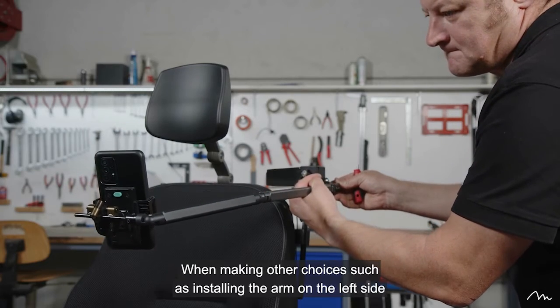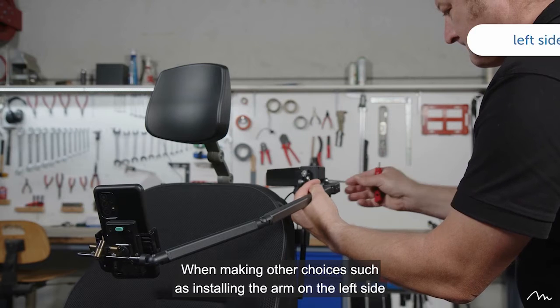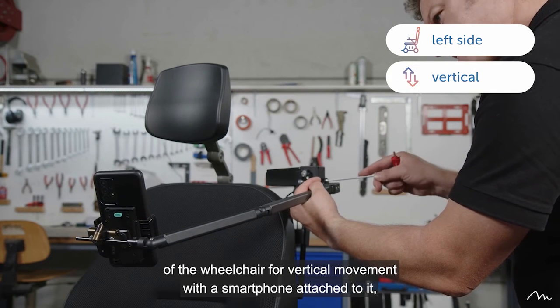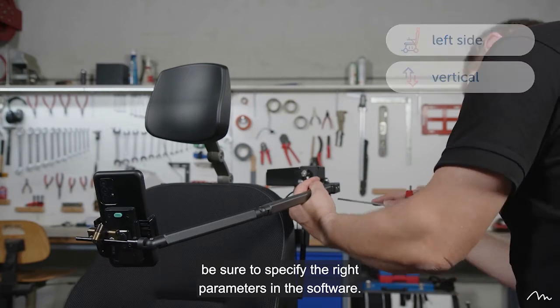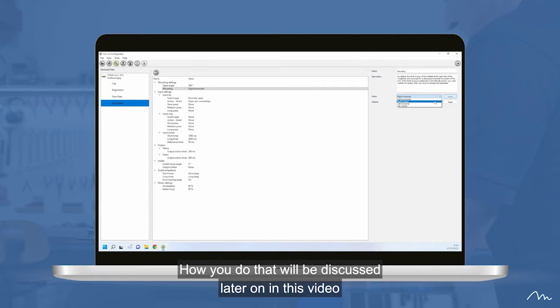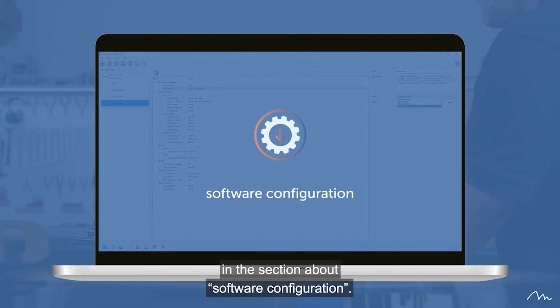When making other choices, such as installing the arm on the left side of the wheelchair for vertical movement with a smartphone attached to it, be sure to specify the right parameters in the software. How you do that will be discussed later on in this video in the section about software configuration.